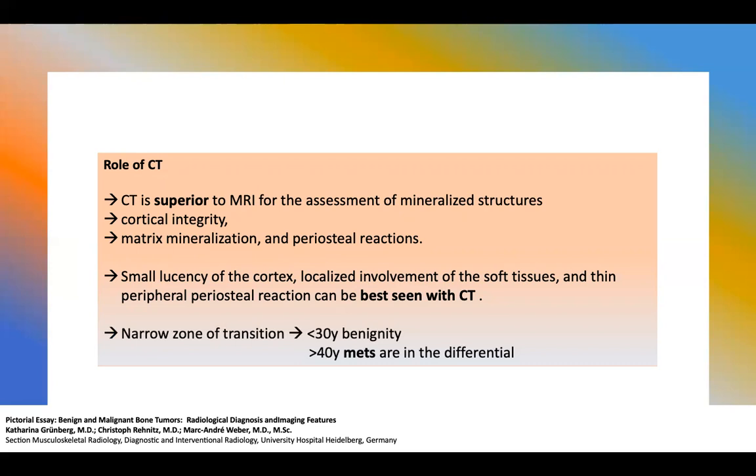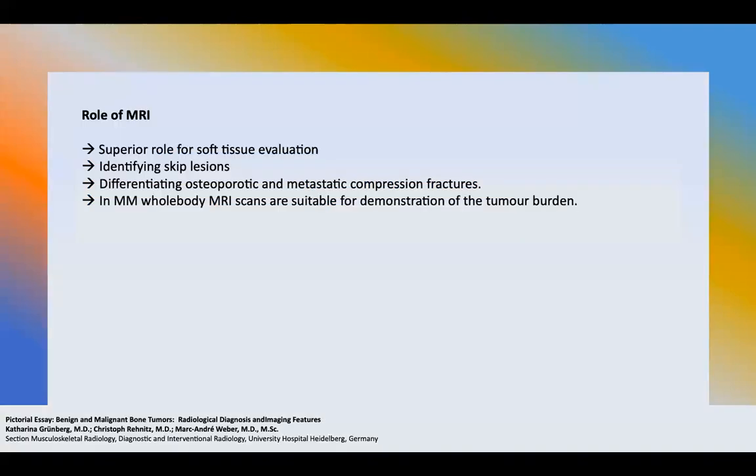What we need to keep in mind is, as we saw earlier, a narrow zone of transition, meaning a well-defined border, equals benignity only in young patients, younger than 30 years old. For patients older than 40 years old, metastases are always in the differential diagnosis.